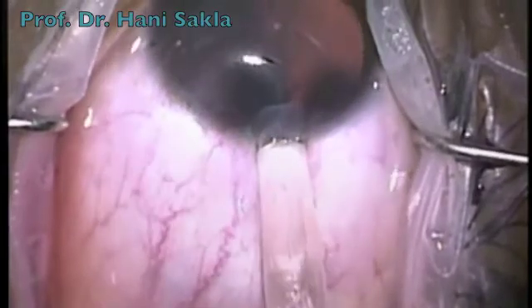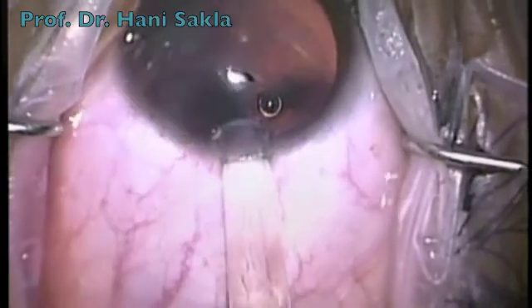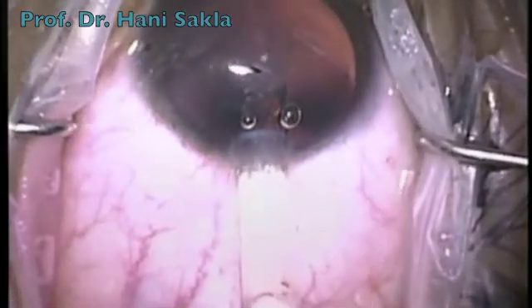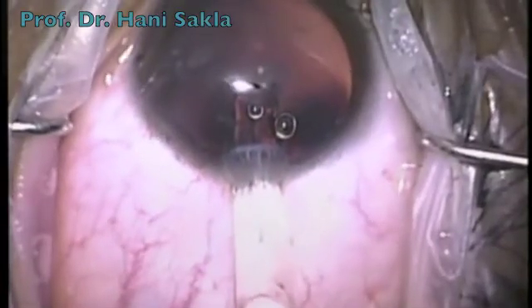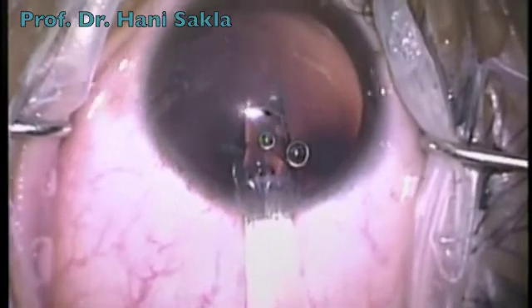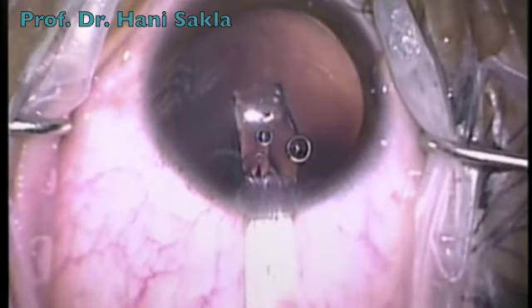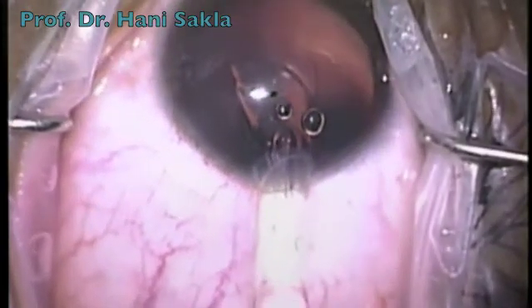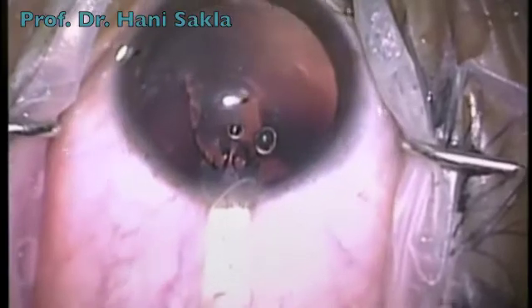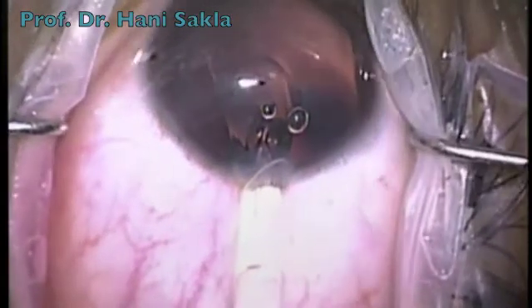Then the tip of the cartridge is placed firmly at the incision and the ICL is injected slowly inside the eye. We have to observe how the ICL is unfolding. We do a gentle rotation of the tip, and we can perfectly control the unfolding of the lens in a proper position.